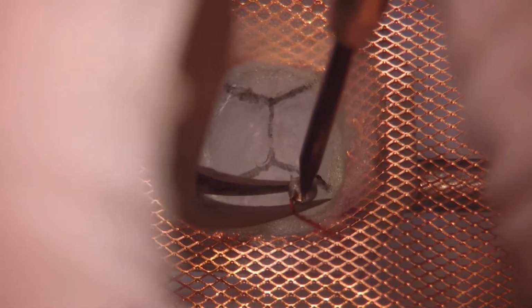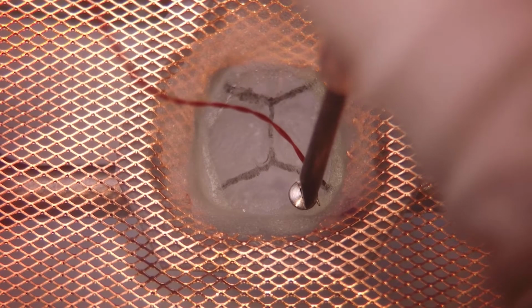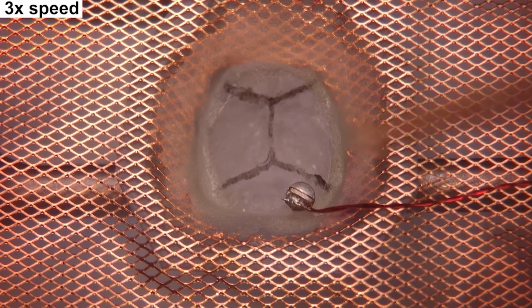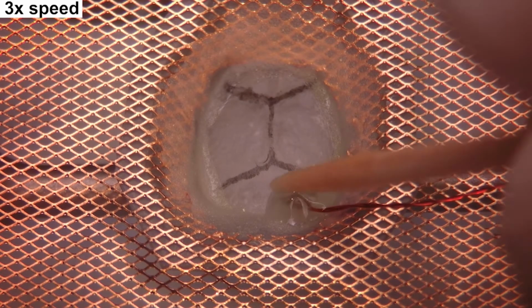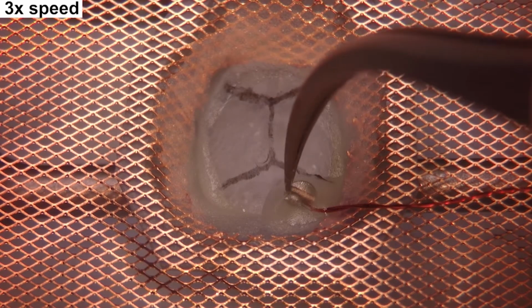And then once the ground screw is in place, we just cover it and seal it with dental cement again, just to make sure that there is no exposed metal inside here. And then once the ground screw is attached and fully sealed, we can start drilling the craniotomy.